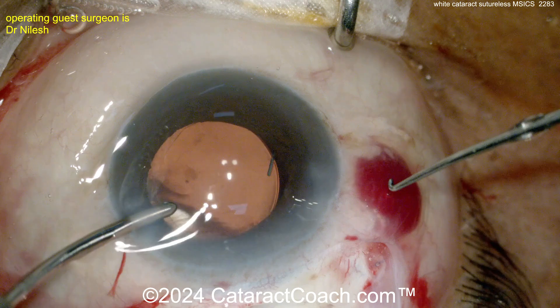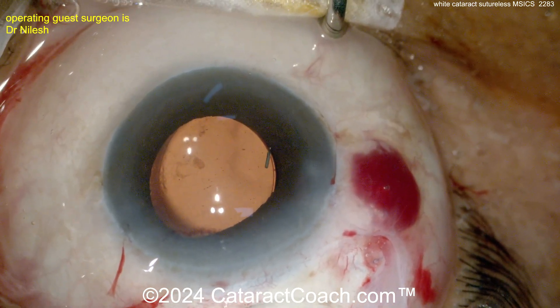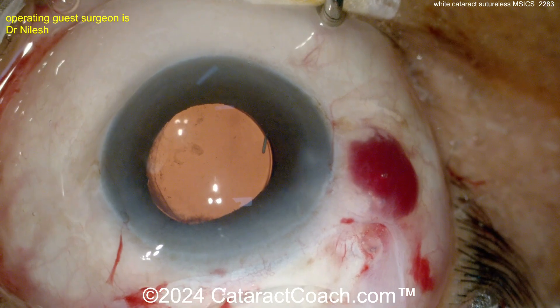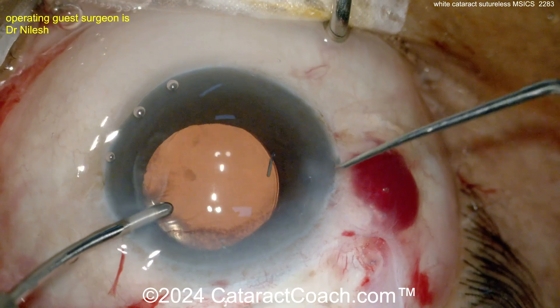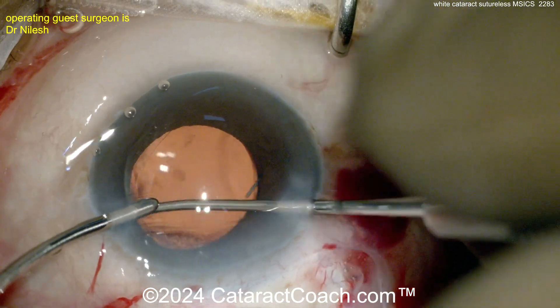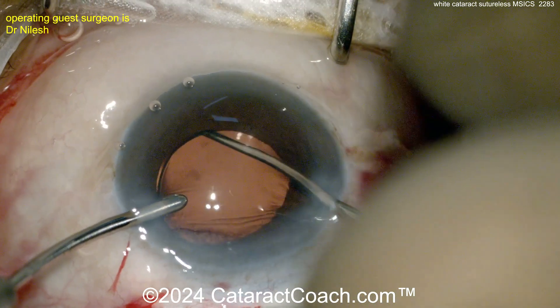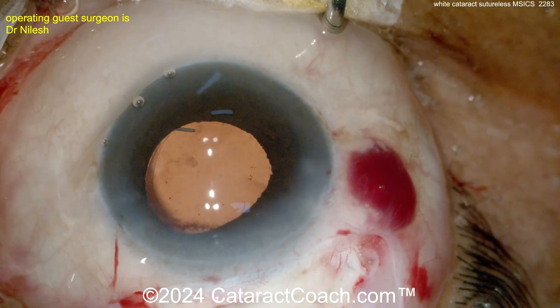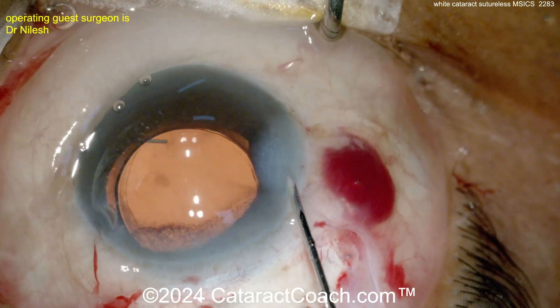Now spinning the lens around — probably trying to loosen any residual cortex, though not much was seen. It looks pretty good and it's time to seal up the incision. In a case like this, I still like to put a suture in — maybe even a couple. There's some question about whether the lens is fully in the bag, hence the extra rotation. Now it's confirmed in the bag. I'd put a suture or two; it won't take long.